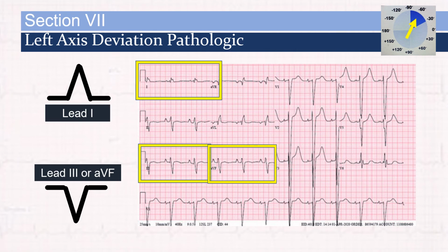Remember, when you're looking at an EKG, left to right considers time, and up and down considers amplitude. The bigger the muscle, the bigger the inflection or deflection on the QRS. Consider the P wave, very small muscle, which creates a very small mark on the EKG, whereas the left ventricle is a large muscle in comparison to the atria, so a large mark.